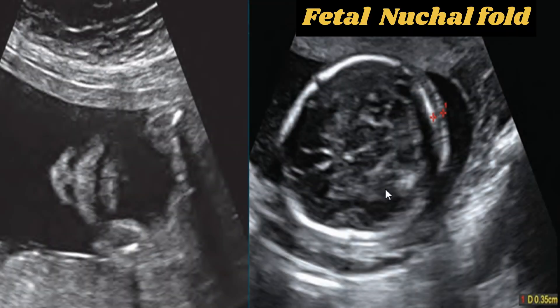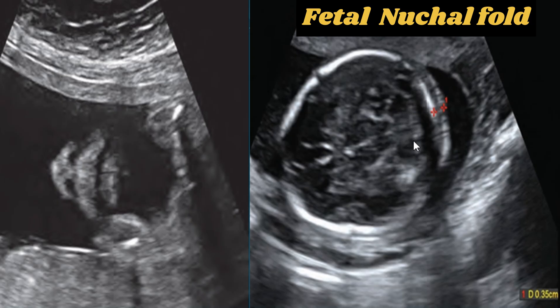Now we are going to discuss the nuchal fold measurement. This is an axial image of the fetal head at 18 weeks and 4 days, showing the cavum septum pellucidum, thalami, and hypoechoic cerebellar hemispheres. The nuchal fold is measured from the outer margin of the occipital bone to the outer margin of the fetal head surface. It measures about 0.35 cm, which is normal — the upper limit is about 0.6 cm.